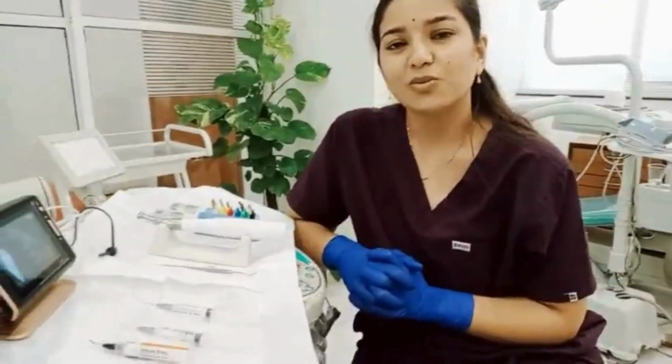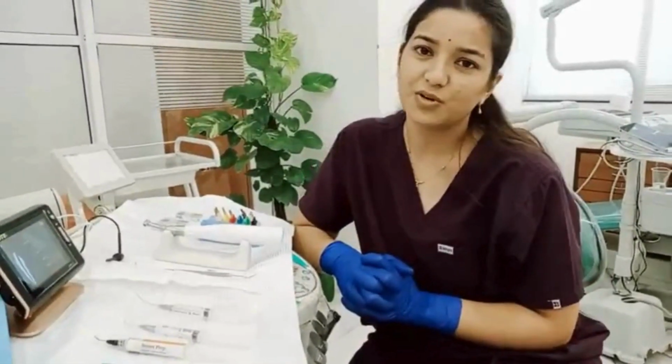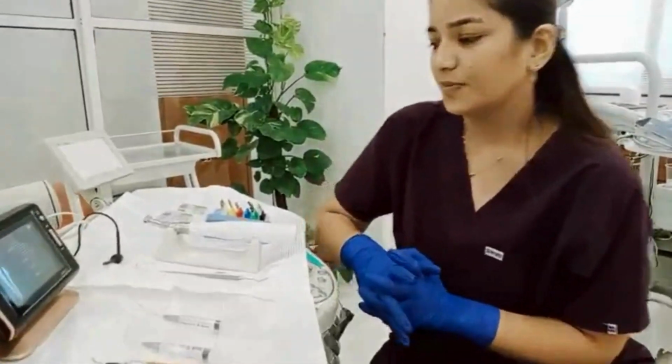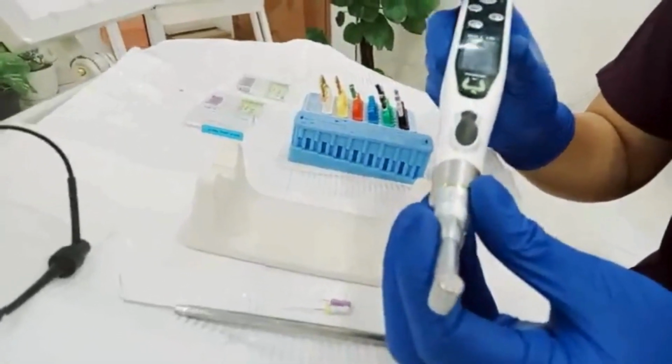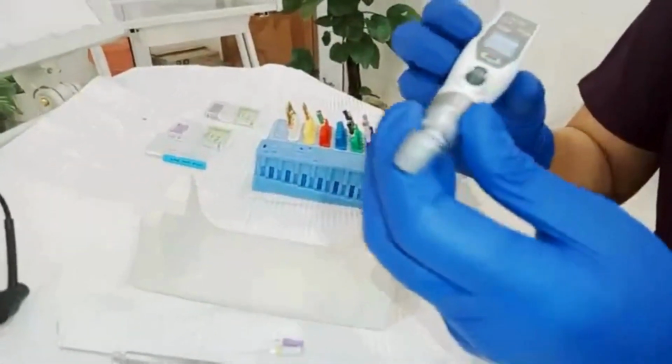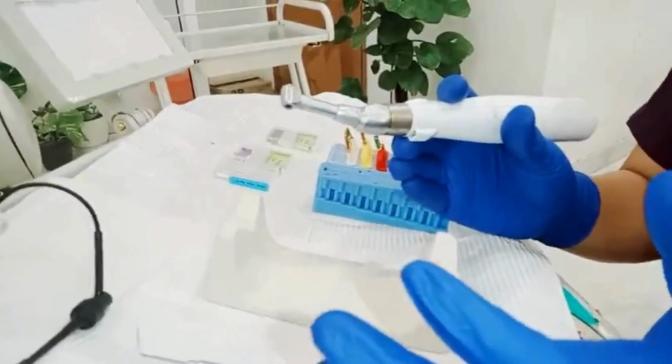Today I am going to tell you about the single sitting RCT which I learned here in my general dentistry course. So let's start with it. Firstly, we'll be using the endomotor. This is the endomotor. Okay. So for single sitting RCT, we'll start with access opening.